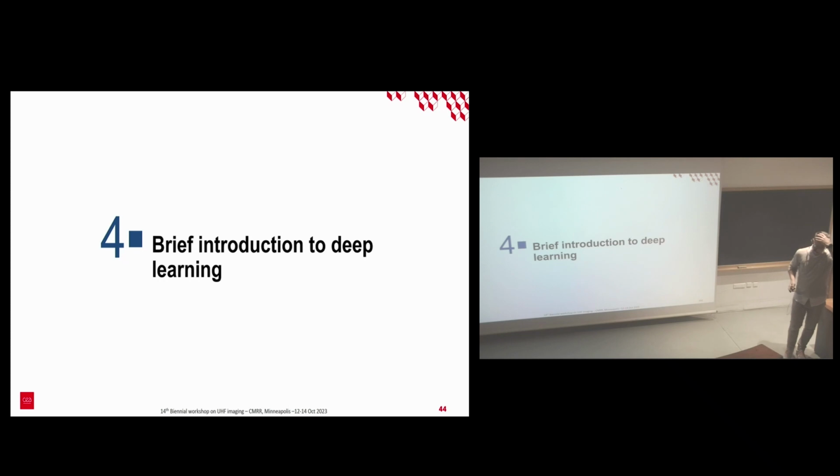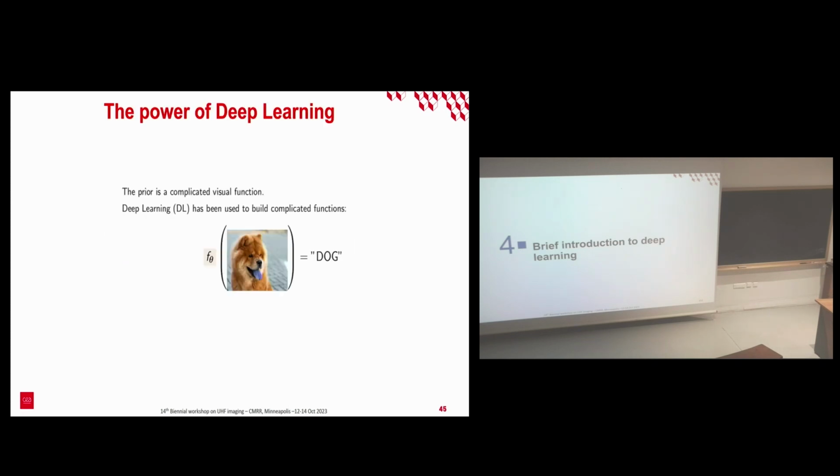So, before diving into specifically deep learning for MR image reconstruction, let's make a brief introduction to deep learning. The power of deep learning will be, of course, to be able to learn prior information from examples, what we call the data-driven approach. And typically, I'm going to explain this by showing you an example.